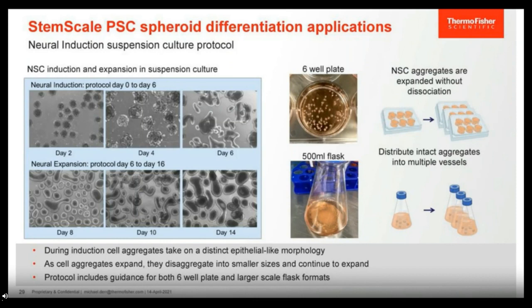This process continues during expansion, and this prevents the size of the aggregates from getting too large. This is quite convenient, and is why there's only a single dissociation step during both of these protocols. Dissociation is not necessary during induction or the expansion stages.